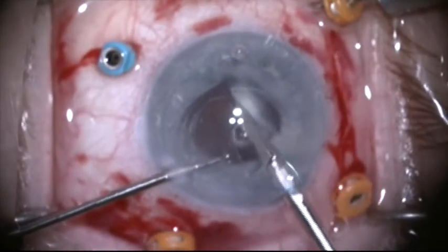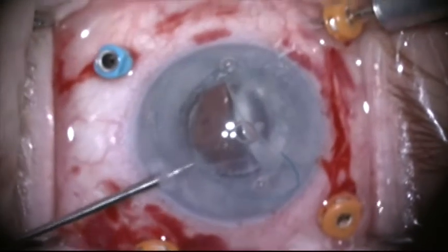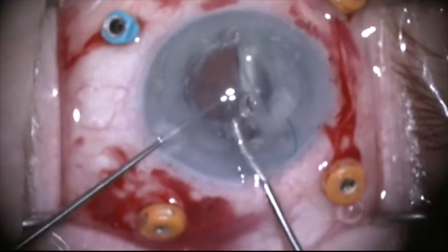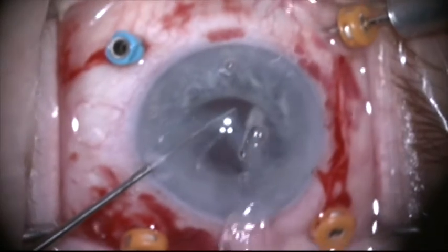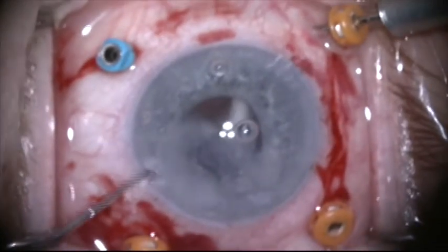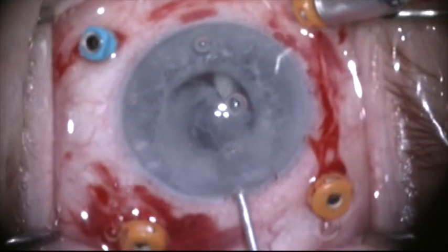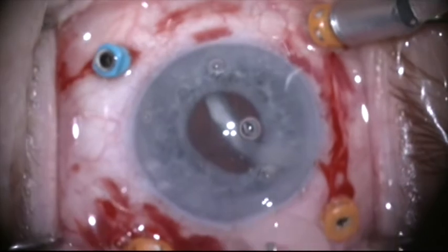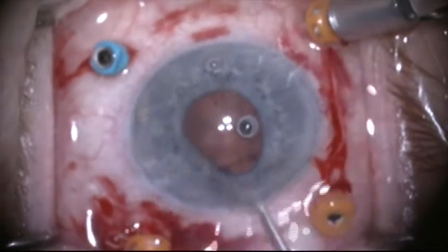Keep in mind that the lens is within the capsular bag here, so it's a bit slippery. I'll cut the lens about 90% of the way through, and when I pull this half out through the clear cornea incision, the other half will follow it so I don't have to worry about it dropping into the back of the eye. You'll see this half come out and drag the second half with it. Now the capsular bag with the Soemmering's ring is left behind.